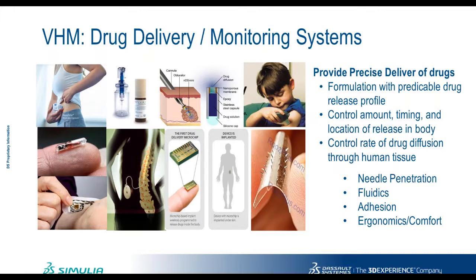This means that in addition to therapeutic efficiency, the design of the actual delivery mechanism must consider such factors as the penetration of skin, the adhesive interaction between the device and skin, the fluidics involved in injection and dispersal of the bolus, and the overall usability and comfort of the device.